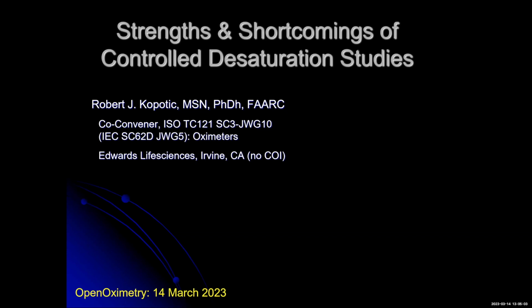We started with an organization called the ASTM, and this is the same company or group that certifies corrugated boxes, slurries of asphalt on the street, concrete in buildings. And they also had responsibility for medical devices for a period. So that was ASTM, and you'll find the earliest 9919 standard was ASTM based. So we have tried to make sure that the two criteria that Sandy has mentioned, essential performance and safety, are integrated well into that standard.